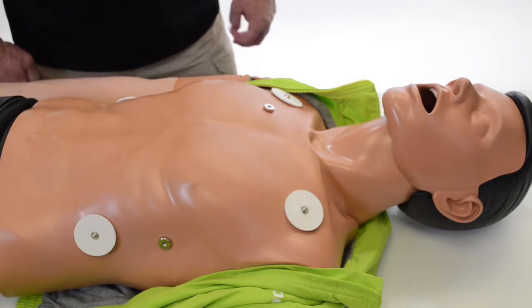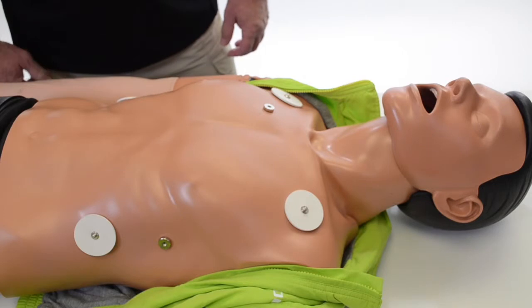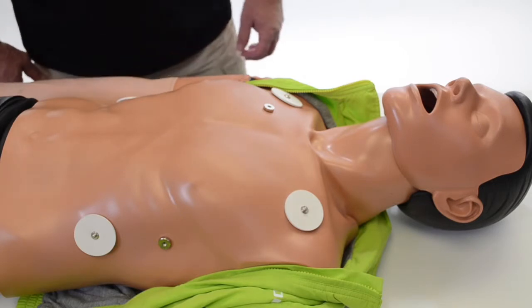When you use AED pads, do not discharge energy to the mannequin. It will burn the mannequin.